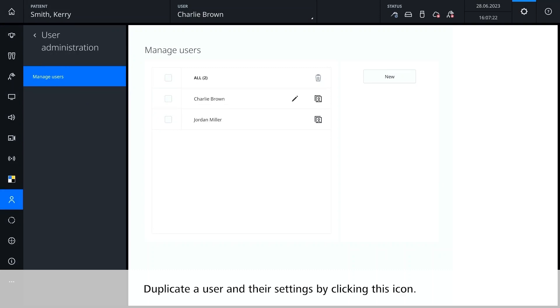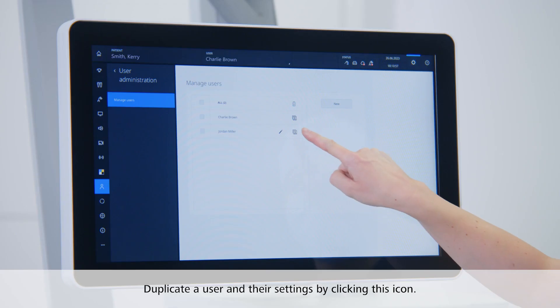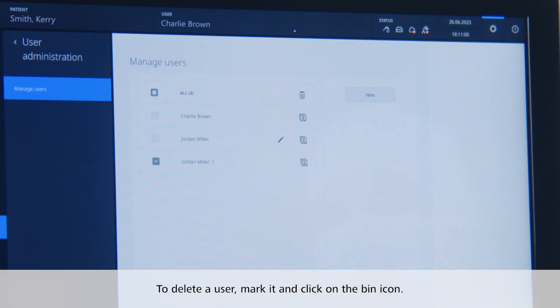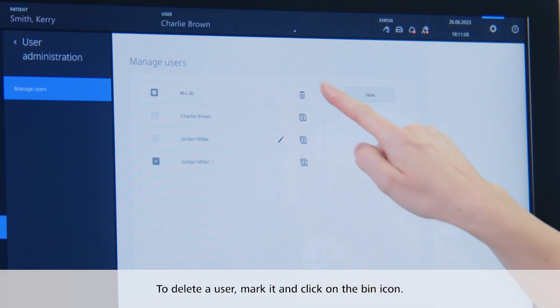You can duplicate a user and their settings by clicking this icon. If you want to delete a user, you need to mark it and click on the bin icon.